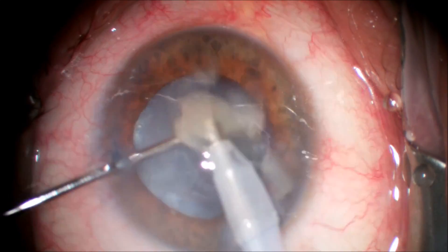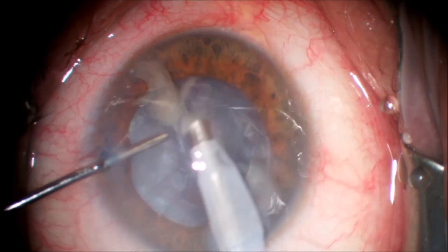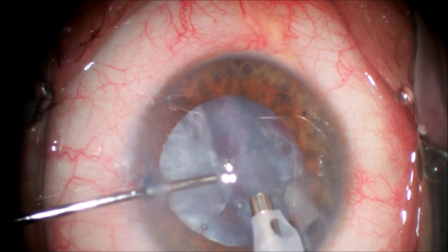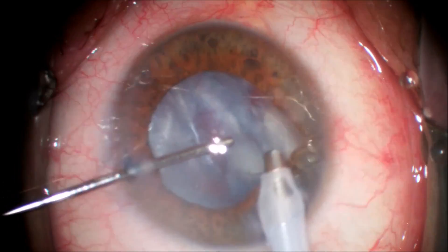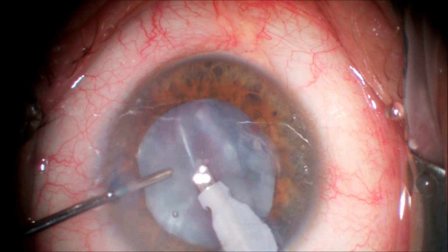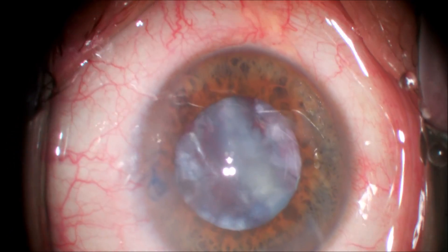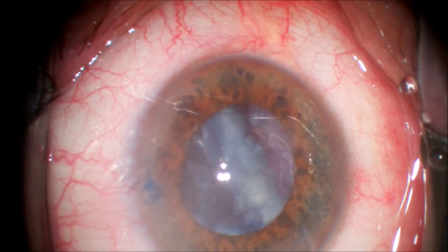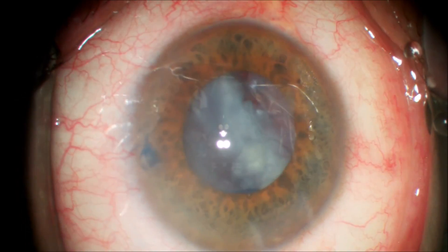Once the nucleus has been removed we will address the cortical material — the soft surrounding layer that is subcapsular. We remove a few free nuclear fragments with the phacoemulsification handpiece. At this point we decide to switch to the automated irrigation-aspiration using a silicone-tipped irrigation-aspiration handpiece.